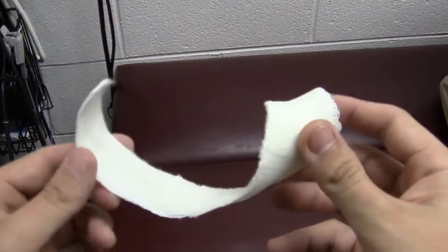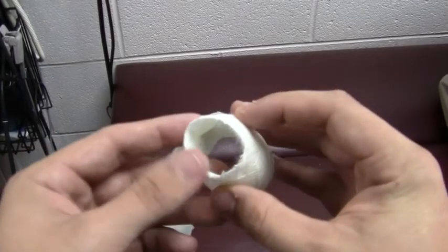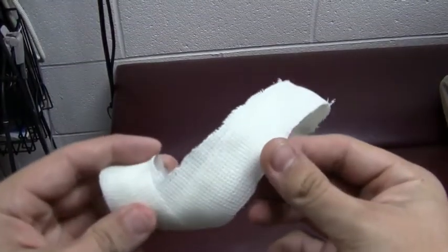Inspect the cast to make sure there are no cracks or sharp edges. Your final product should look similar to the cast shown here.